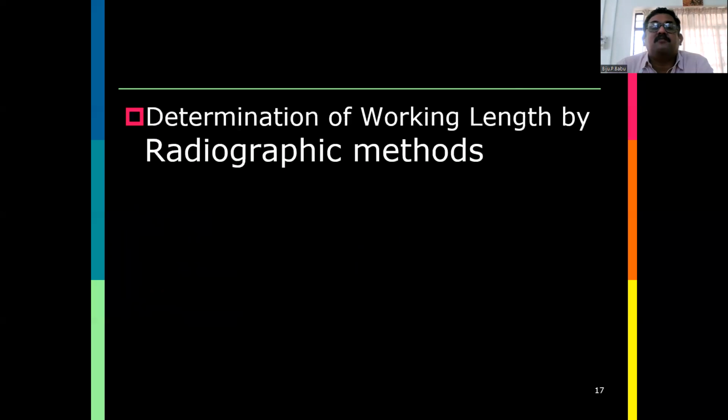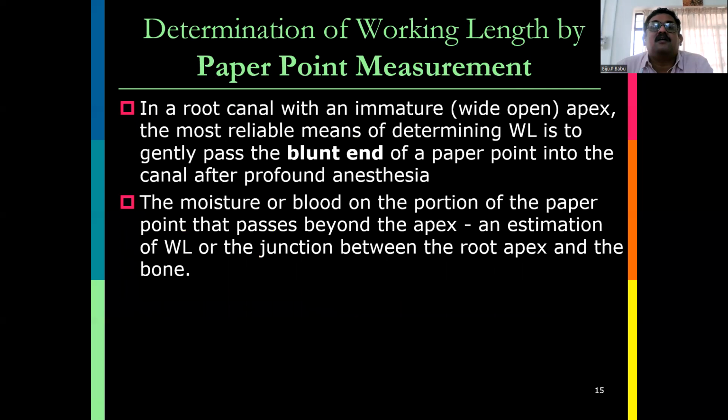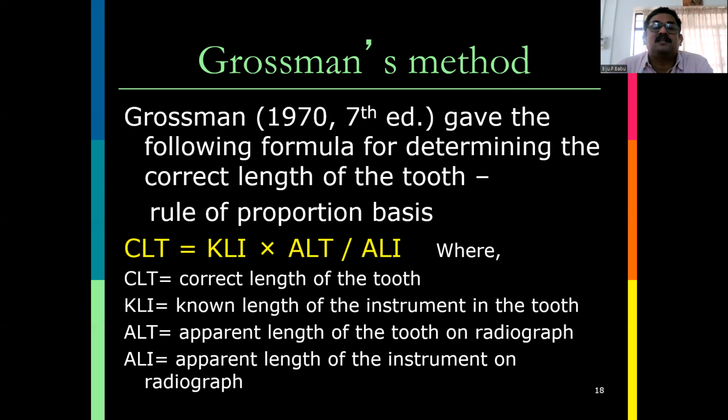Now coming to determination of working length by radiographic method. Next is the Grossman's method of working length determination.